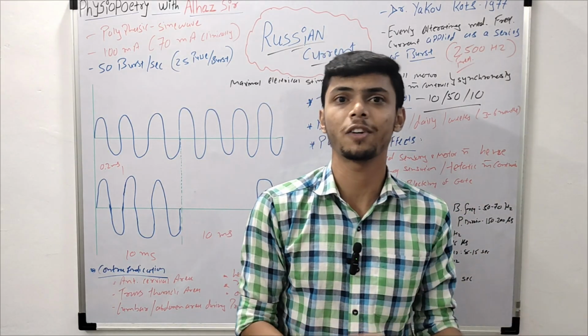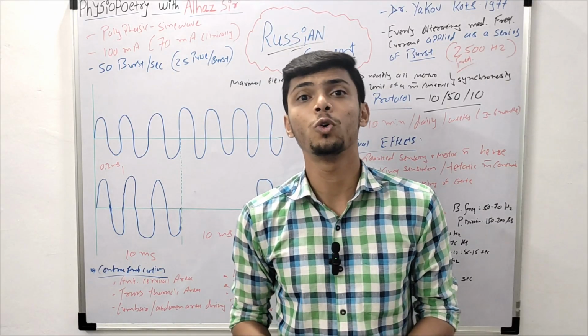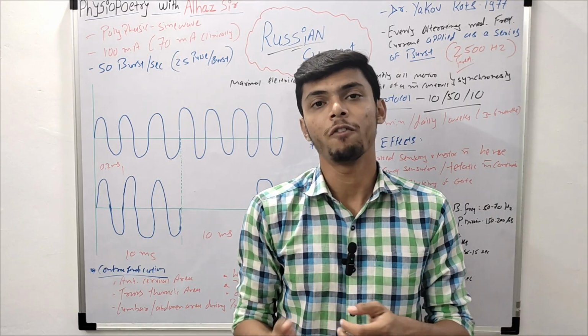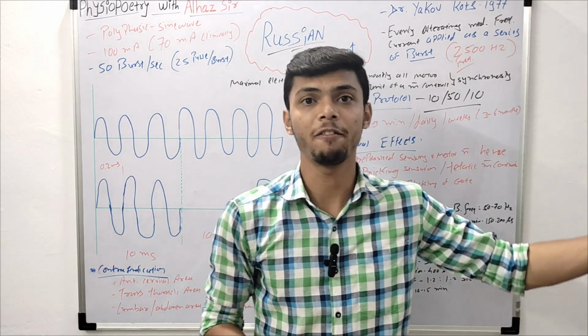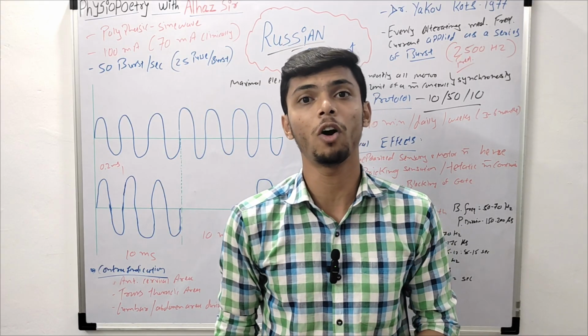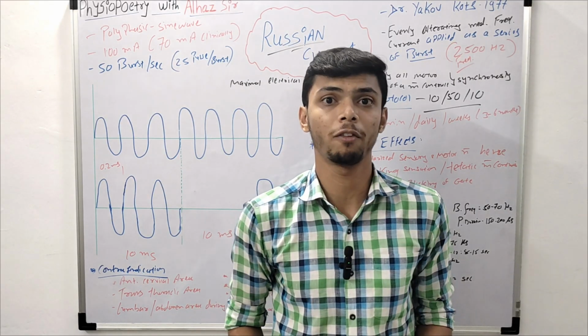So Russian current में ऐसा क्या है? What is special in Russian current which is helpful to strengthen the muscle, to gain that advantage which the Russian athletes have used, which gave them a good result in recovering their muscles and strengthening their muscles.